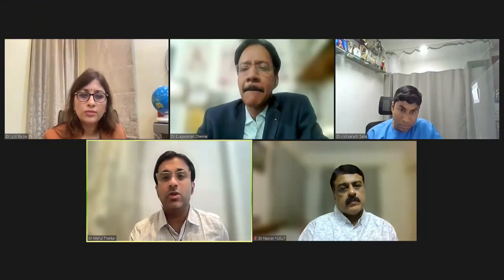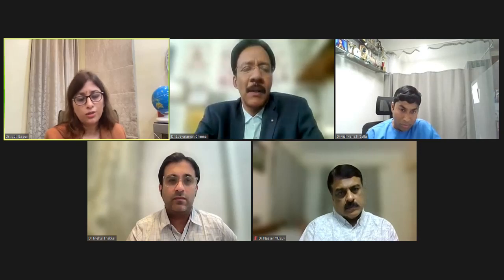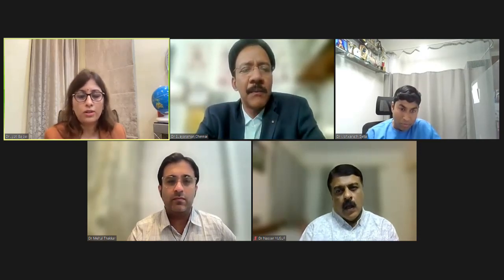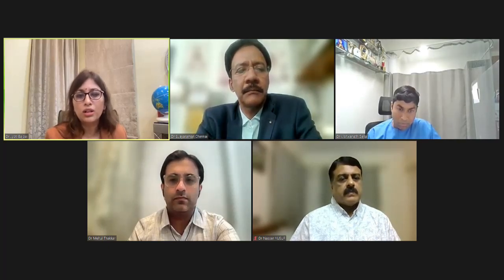Yes. Yeah, and I'd like to ask this question to Dr. Jyoti. Since you're doing it, what is the rate of bleeding that you have noticed in a cryobiopsy patient, and how do you handle it? So as of now, we have not seen moderate to severe cases of bleeding during cryoprobe biopsy through medical thoracoscopy via semi-rigid thoracoscope. The chances of bleeding are very less, and they are mild, just like a forceps biopsy, and it can be managed conservatively. There is nothing to worry about during cryobiopsy.